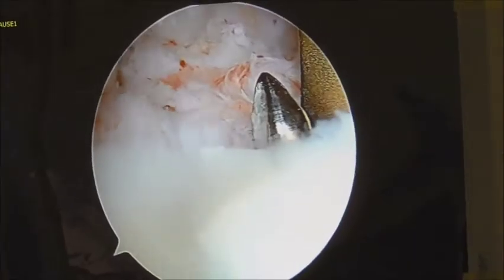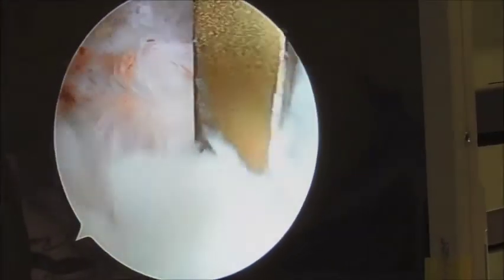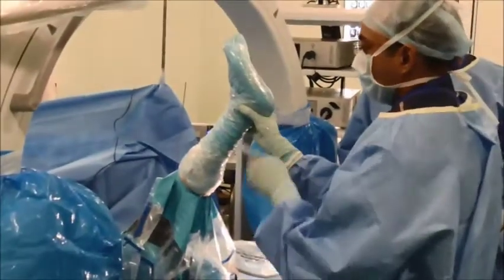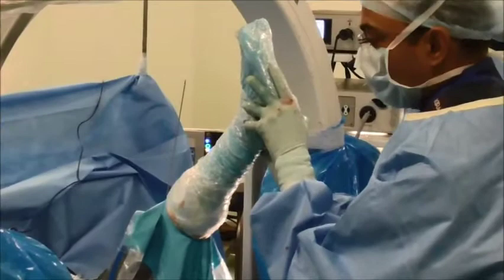The guide pin is then passed, and once it is passed, it is slowly withdrawn just to bring its tip at the level of the tibial plateau. The aiming jig and the arthroscope are withdrawn, the leg is put into hyperextension and a C-arm shot is taken.